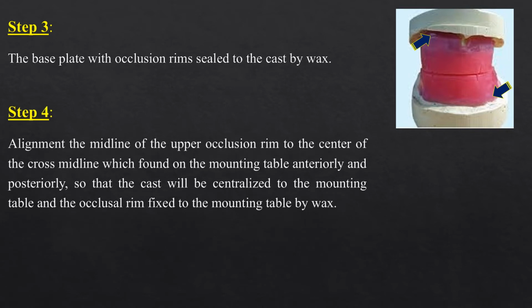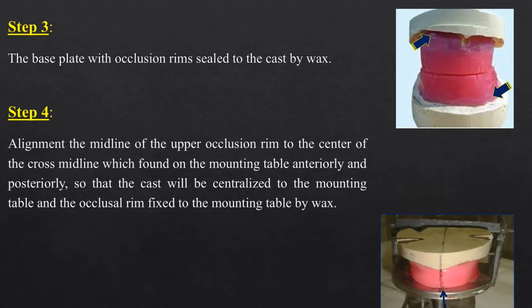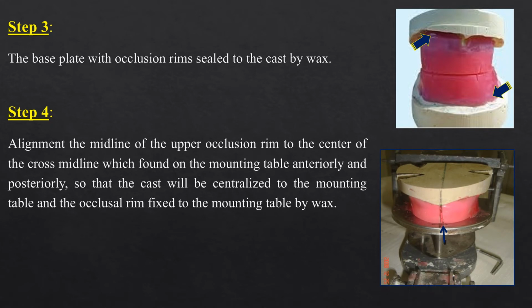Step 4. Align the midline of the upper occlusion rim to the center of the crossed midline which is found on the mounting table anteriorly and posteriorly, so that the cast will be centralized to the mounting table and the occlusion rim is fixed to the mounting table by wax.